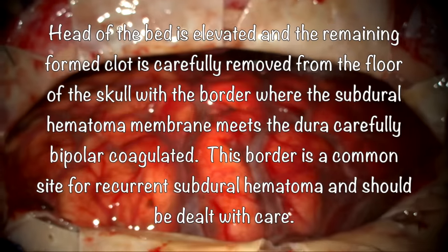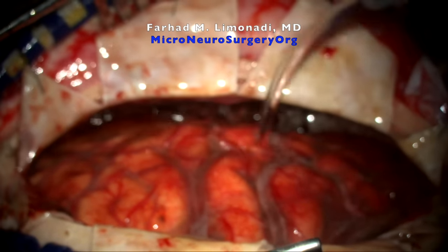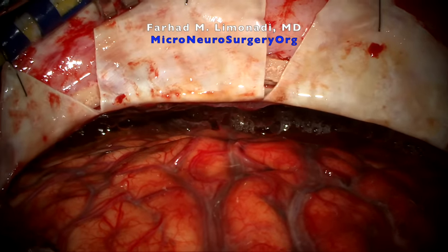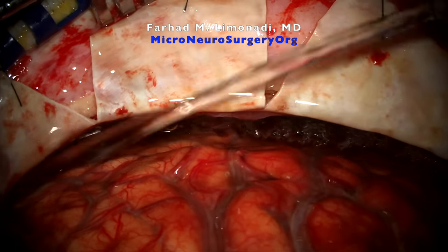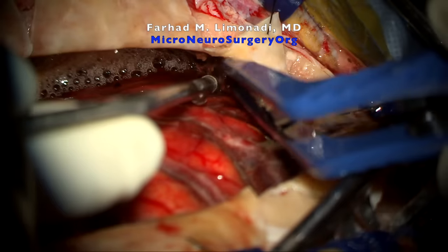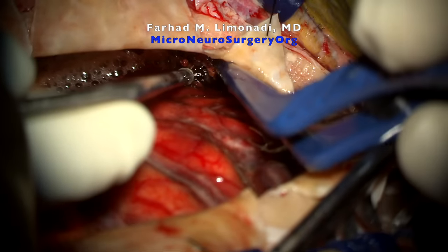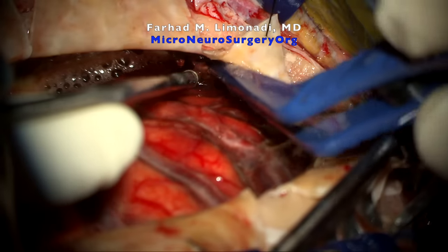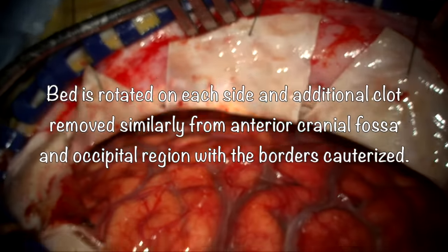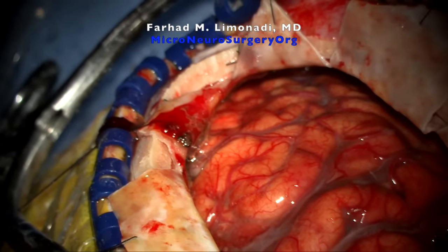The head of the bed is elevated, and the remaining formed clot is carefully removed from the floor of the skull, with the border where the subdural hematoma membrane meets the dura carefully bipolar coagulated. This border is a common site of recurrent subdural hematoma and should be dealt with care. The bed is then rotated to each side, and additional clot is removed similarly from the anterior cranial fossa and occipital region, with the borders cauterized.